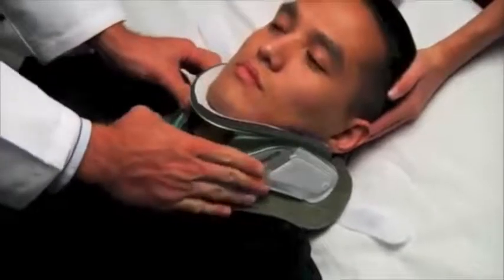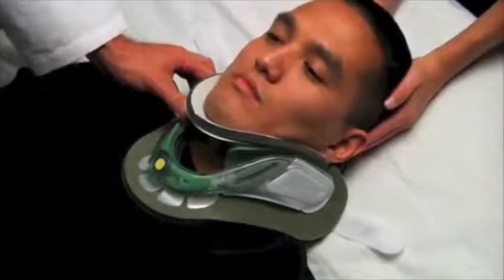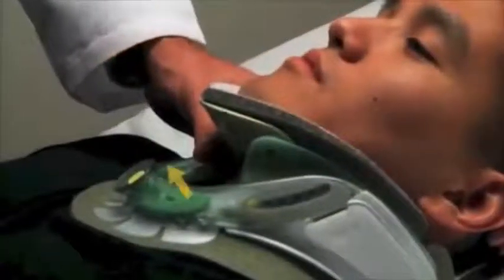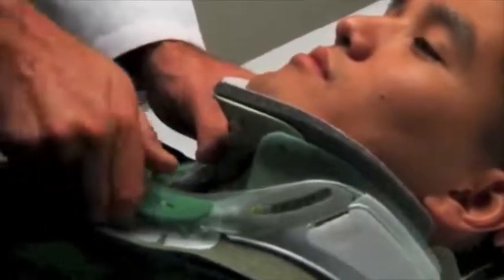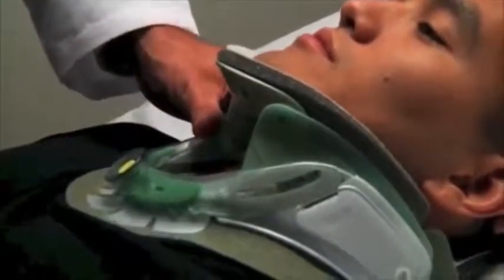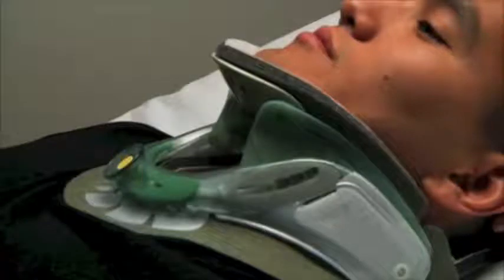Pivot the collar down and in, keeping the chin piece in contact with the chin as the sides are positioned over the trapezius muscles. Gently pull the dial outward to unlock and then turn clockwise to dial up until the foam pad on the chin begins to compress. The height adjustment dial will automatically lock into place when you let go.